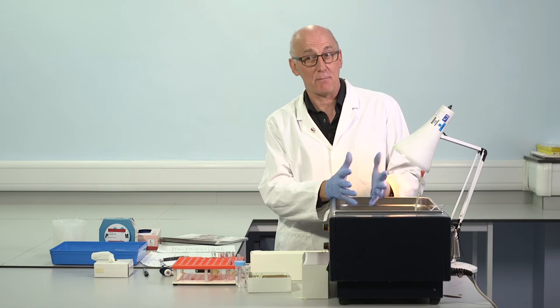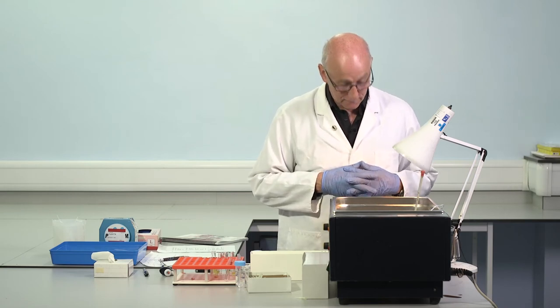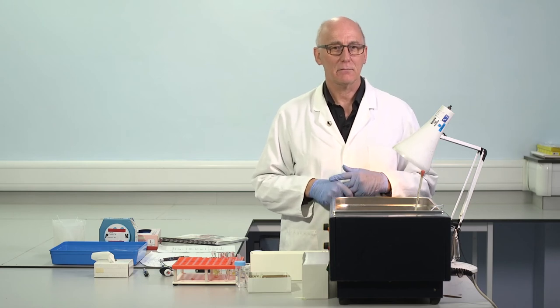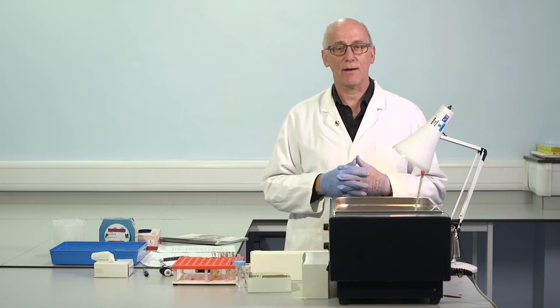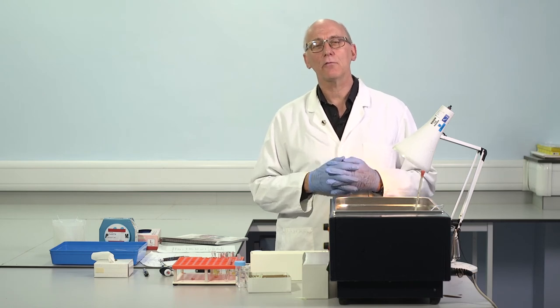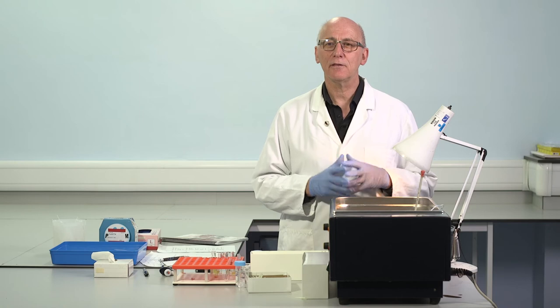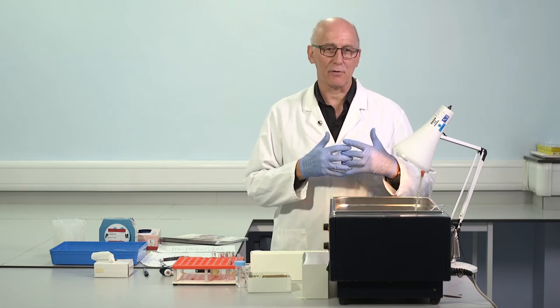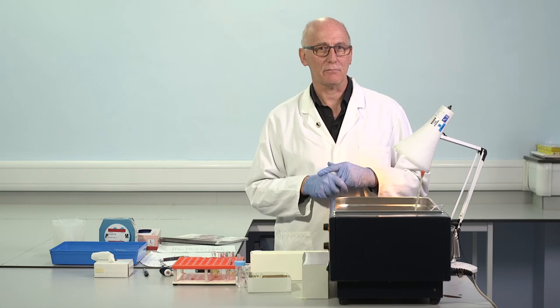The problem with incubated mixtures, in my opinion, is that they can be difficult to interpret. If we have a very strong, powerful inhibitor present with a high titer, particularly 5, 10, 20 Bethesda units per mil, the results are fairly clear-cut. It's fairly obvious that an inhibitor is present. The problem is when there is a low titer antibody, 1, 2, maybe 3 Bethesda units. But this is an important area because it may have an important impact on decision-making in terms of treatment options. Some guidelines have a threshold for different decision-making at 5 Bethesda units per mil, but decisions can also differ according to antibody titer at lower levels.